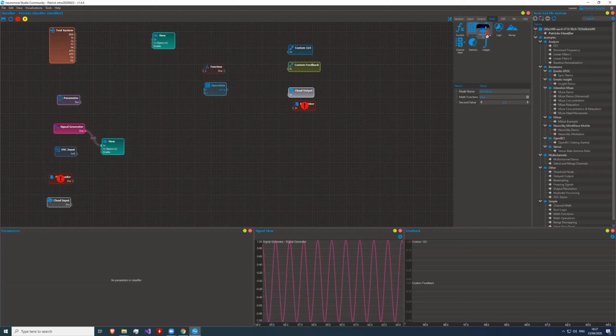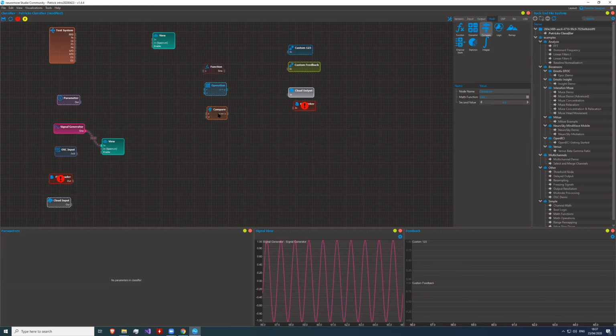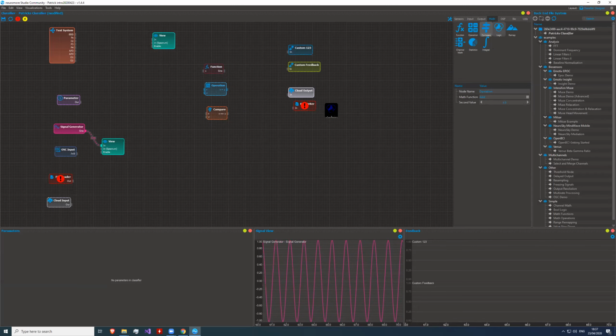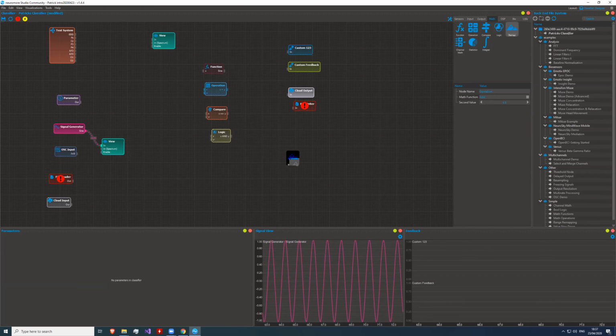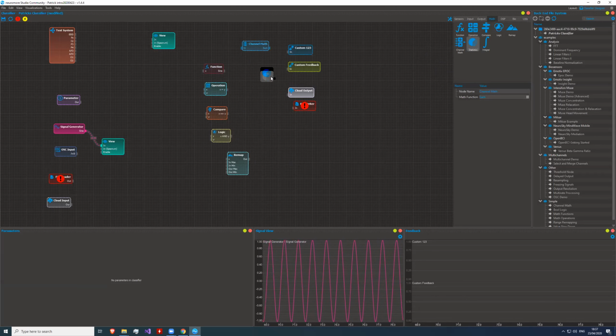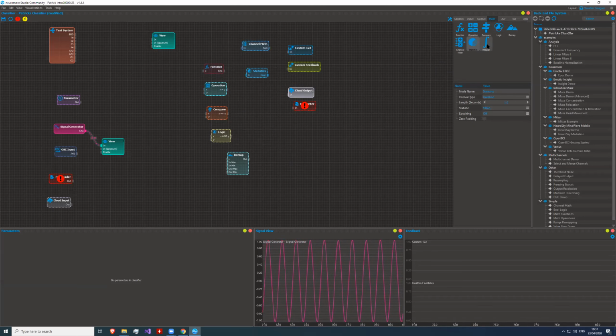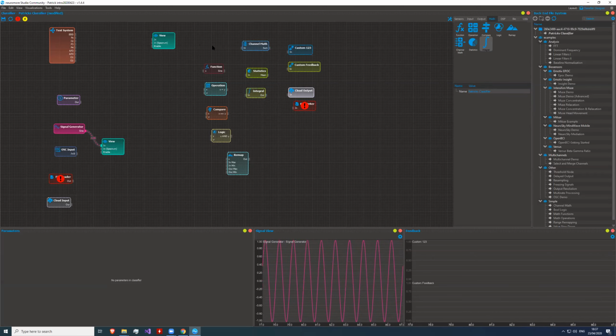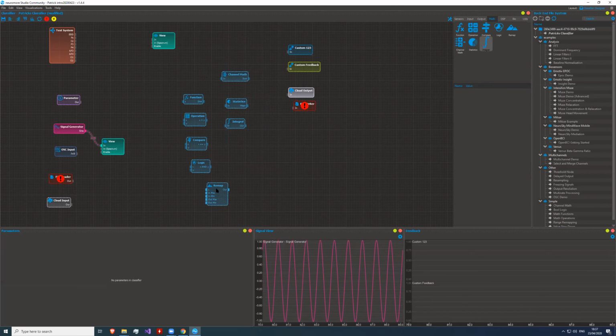There are some simple mathematical operations, comparisons, logical functions, and some remapping. You can do channel mathematics, like summing up two channels. You can do statistics, and you can do an integral with some of those things. So that's all still pretty standard.